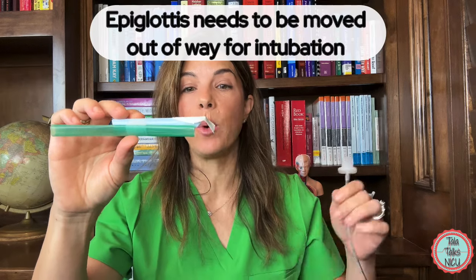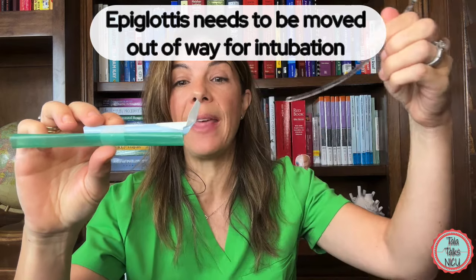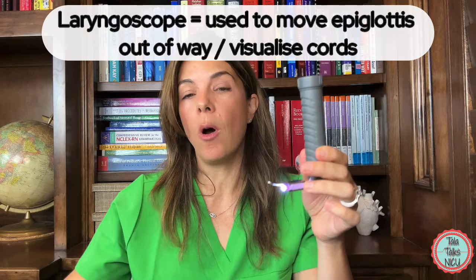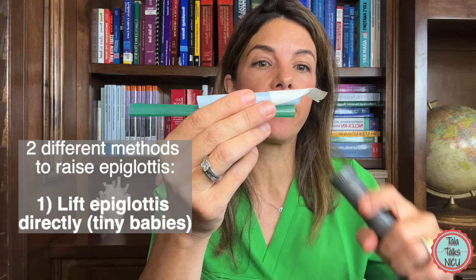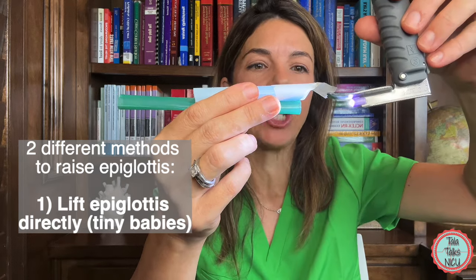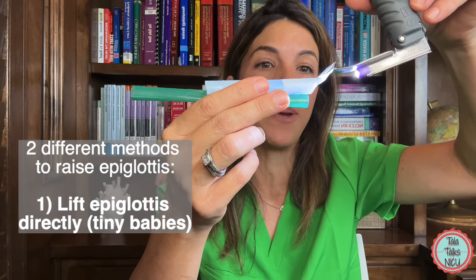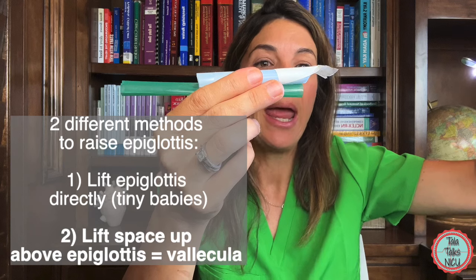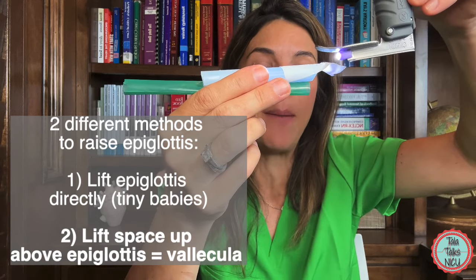The trick is we need to get that epiglottis out of the way so we can thread the endotracheal tube down into the trachea. What we use for this is something called a laryngoscope or a blade. The blade opens the mouth so you can see, but what you're trying to do is get the epiglottis out of the way to thread the endotracheal tube through the vocal cords and into the trachea. In tiny babies, there isn't a lot of room in the mouth, so you catch the edge of the epiglottis so the vocal cords drop into view. In older babies, you go for the space directly above the epiglottis, called the vallecula.